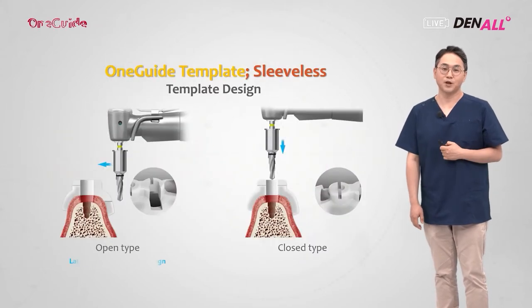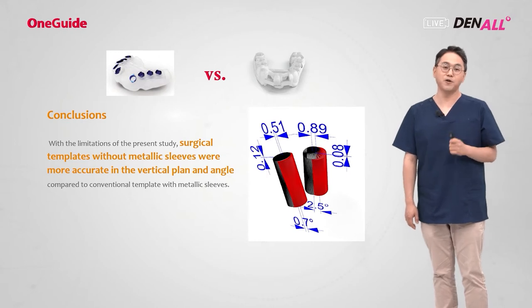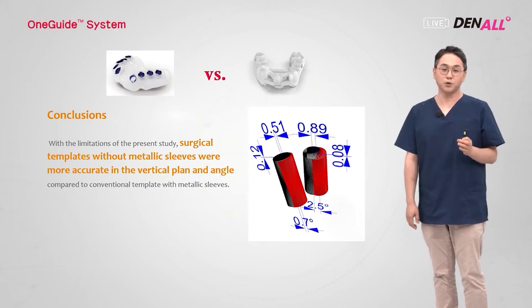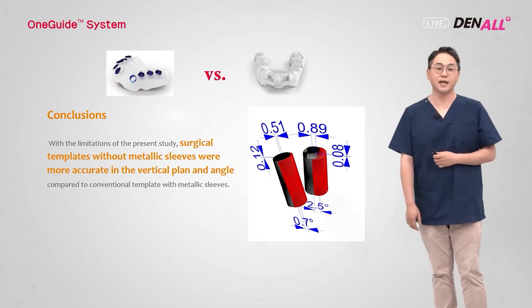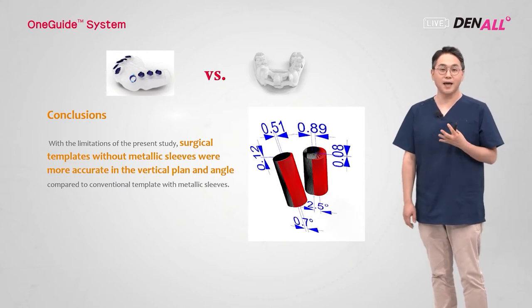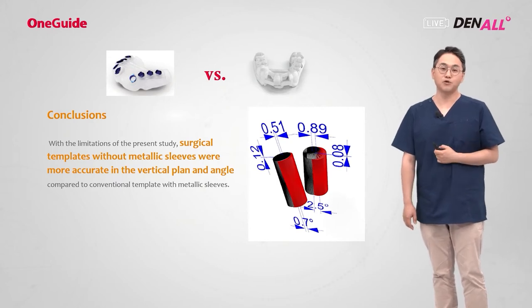What do you think is the result of the analysis? As you can see, the group where implants are placed with a surgical template with a metal sleeve has many more vertical and angular errors. As I said before, the metal sleeve's positioning errors can cause implant vertical errors due to the unstable metal sleeve, which causes angular deviations. Therefore, based on this research, I don't believe the metal sleeve increases the accuracy of implants placed with the guide system. The OneGuide template without a sleeve shows superior accuracy.